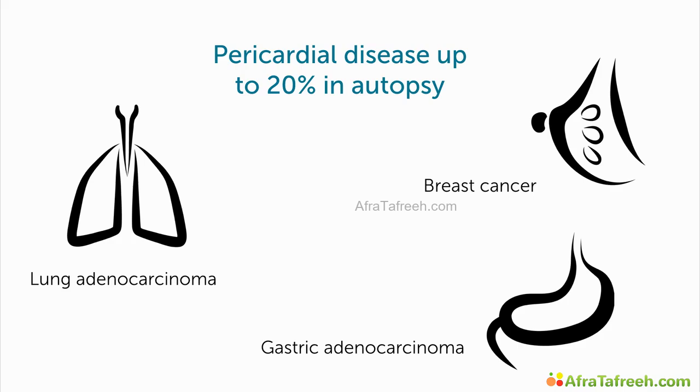Always be on the lookout for a pericardial effusion in patients who have cancer. We know from autopsy studies that 20% of patients with cancer actually have a pericardial effusion, especially if patients have lung adenocarcinomas, breast cancer, or gastric adenocarcinomas, or esophageal tumors.